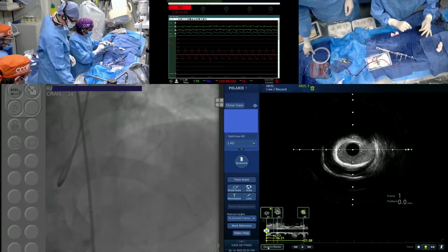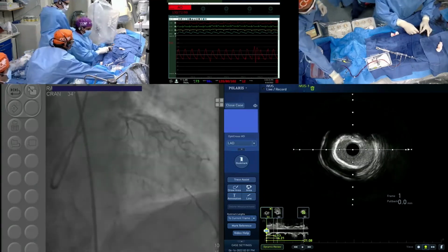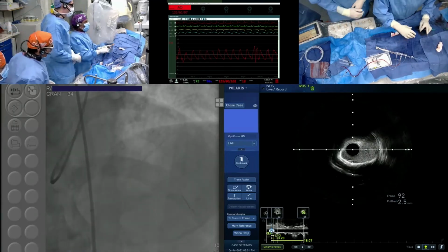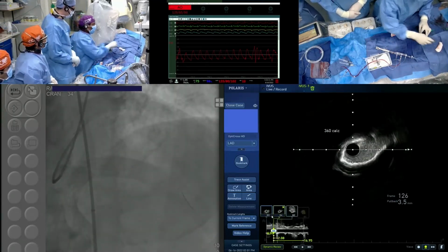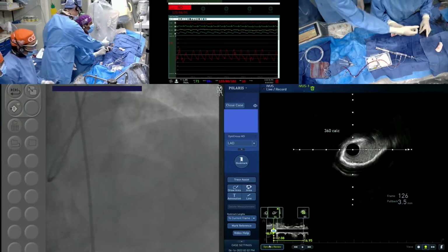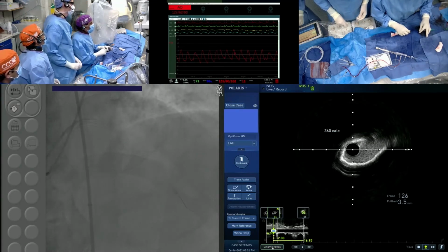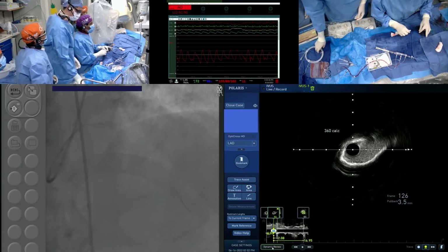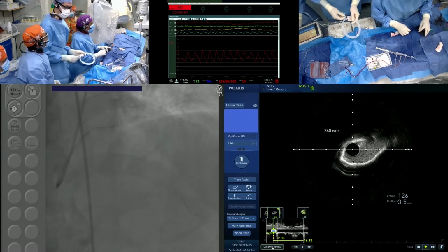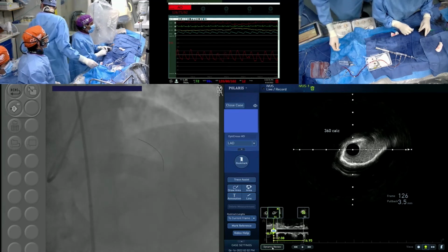So we are going to cover it, and we have actually published that you go from proximal to distal segment with a long segment of stent. We have a JACC Interventions case report: when the patient comes back after proximal to distal stenting, you don't need the covered stent. There will be no flow in the aneurysm, and we had a follow-up CTA and angio on that RCA with one of the fellows, which we presented and published. Because of low flow, it closes up by itself. Flow becomes very little, so the aneurysm actually becomes half in size.